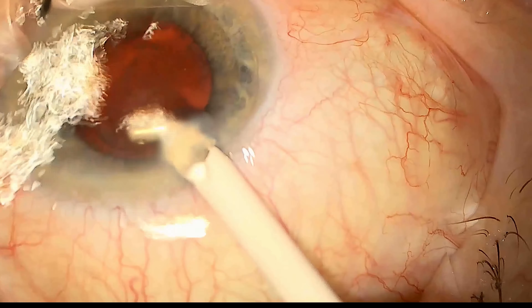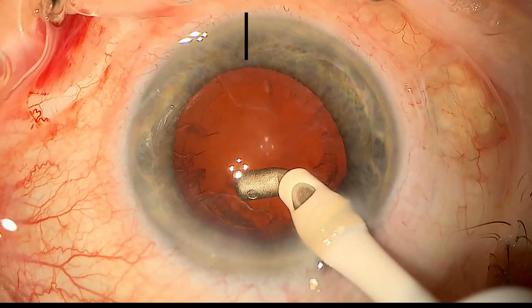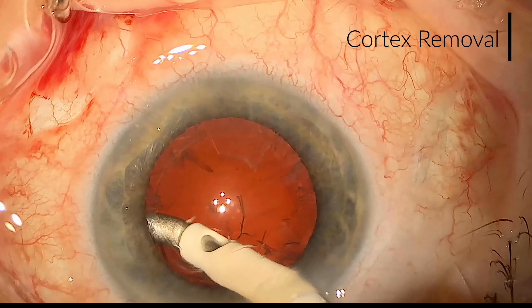And we're just left with the cortex material which we're able to vacuum away using irrigation aspiration.